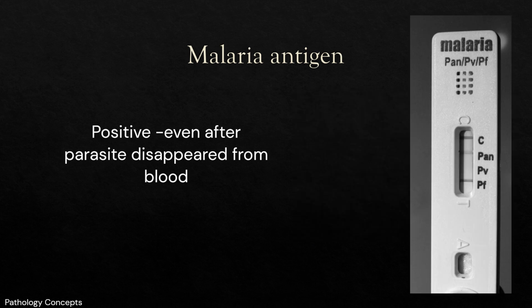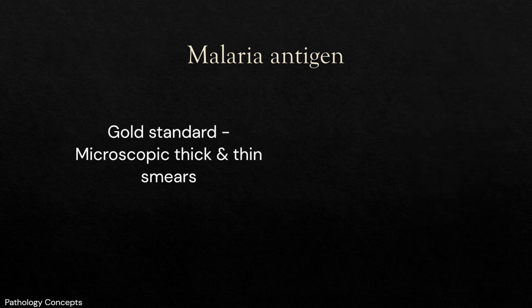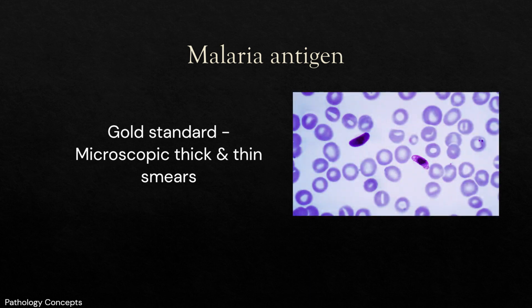HRP2 has been shown to persist and is detectable after the clinical symptoms of malaria have disappeared and the parasites have apparently been cleared from the host. The recommended method and current gold standard used for routine laboratory diagnosis of malaria is microscopic examination of the stained thin and thick blood films, particularly with the additional sensitivity offered by examination of the thick blood film.